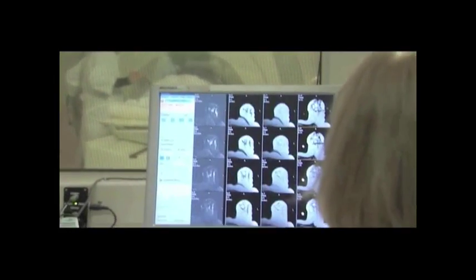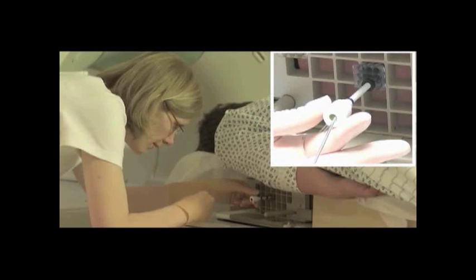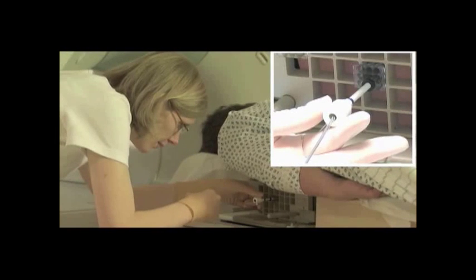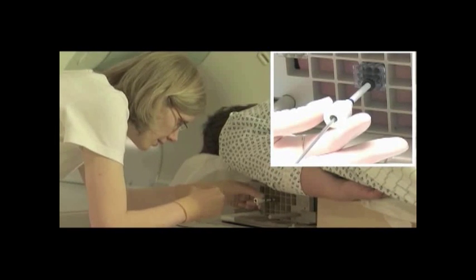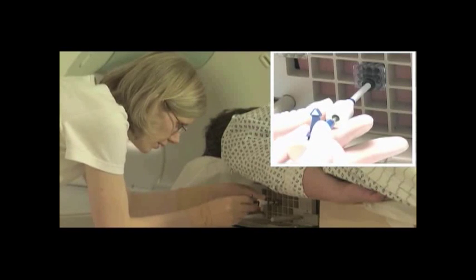You are now ready to place a biopsy site marker. The ATEC TriMark Biopsy Site Identifier will be used for this demonstration. Remove the localizing obturator and place the marker deployment device into the introducer sheath until the aperture indicator contacts the introducer sheath hub.